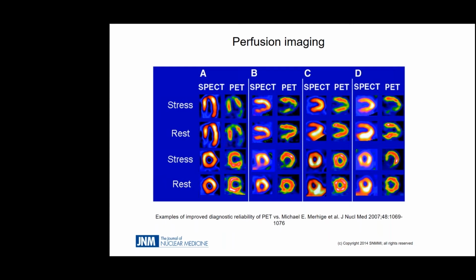Here, the main application is perfusion. So they're looking at where blood is going in the myocardium and seeing if there are places where blood is not quite reaching. This is a number of subjects, places where blood might not be reaching the myocardium. So perfusion defects, and this can help us then determine what is the best treatment plan.